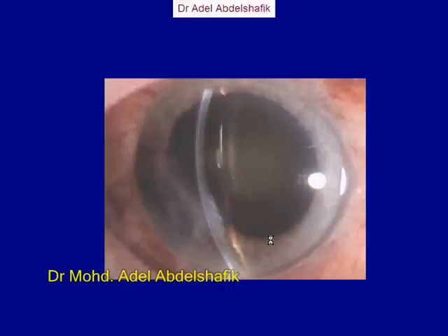What do you notice here in this picture? We noted that in this section here, you get increased thickness in this part. So it's localized edema of this part of the cornea. If you want to know the extent, how laterally this is extending, then you have to move your section to these different parts.